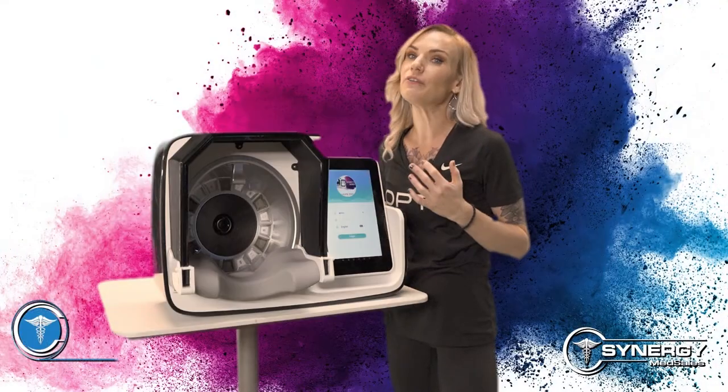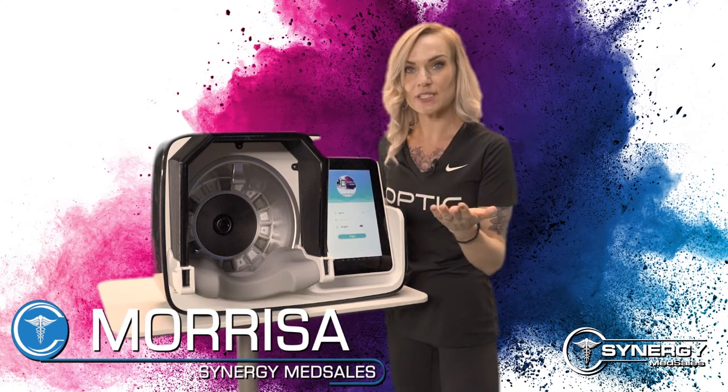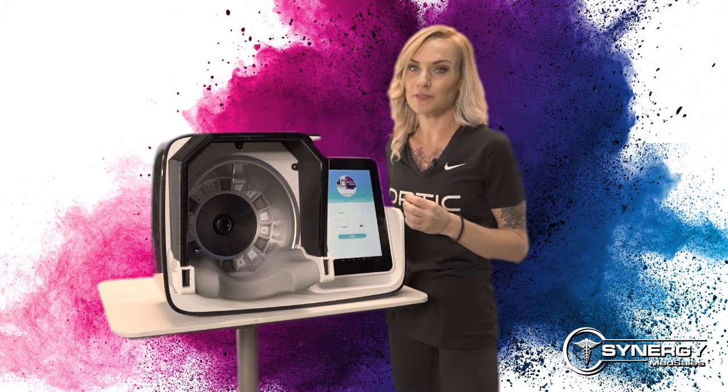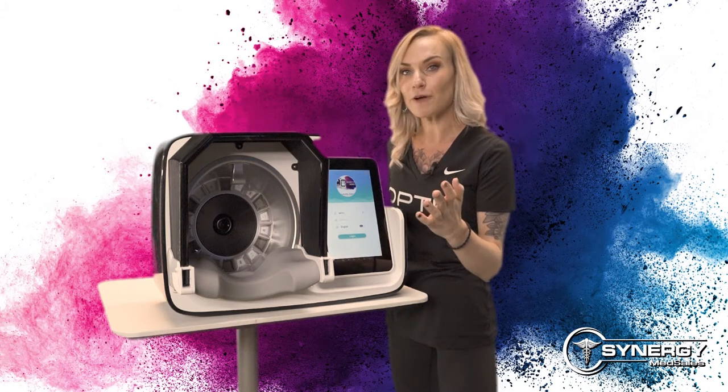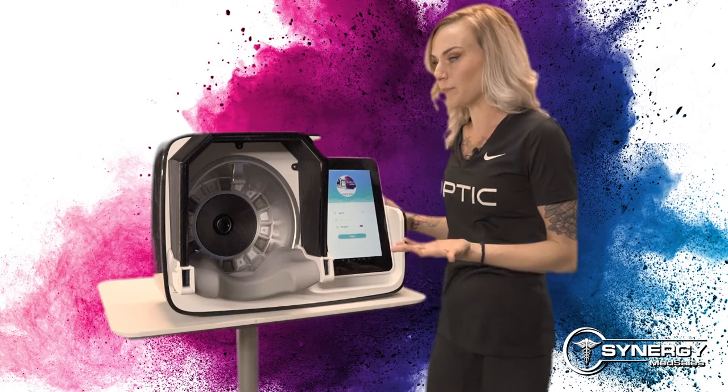First off, I want to give you an overview. The Optic is going to scan your patients for 10 different skin conditions. It's going to make the product and service recommendations that you offer based on its findings and show before and after photos. Let's talk a little bit about the hardware.